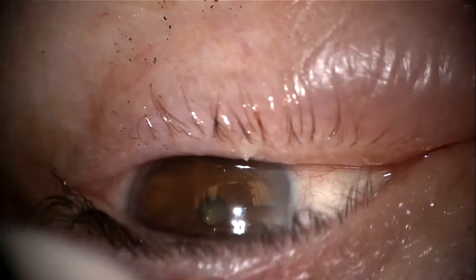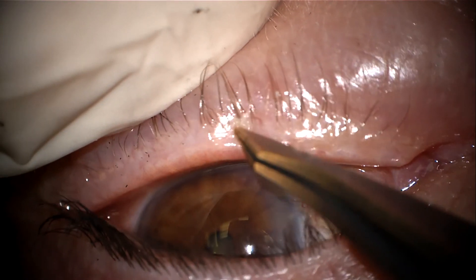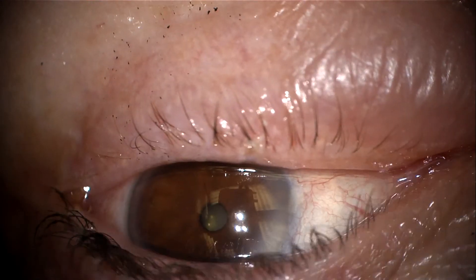Here you can see that the eyelash comes out with minimal tension, and then I'm just ensuring that I've not left anything behind and that I have in fact removed the whole eyelash. I applied Tobradex ointment to the site.